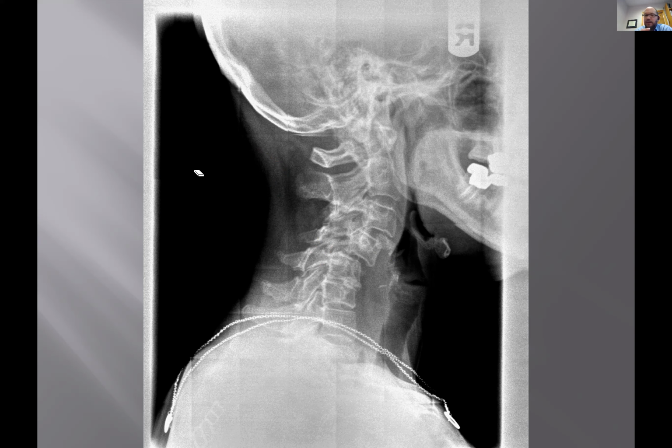All right. We've got to get through two more cases, so let me cut to the chase here. Myelogram, or probably in the Twin Cities, we would go ahead and get an MRI to see what's happening. But there's also what else is probably happening in the mid-cervical spine from a functional instability. Right. And so how are you going to prove that?